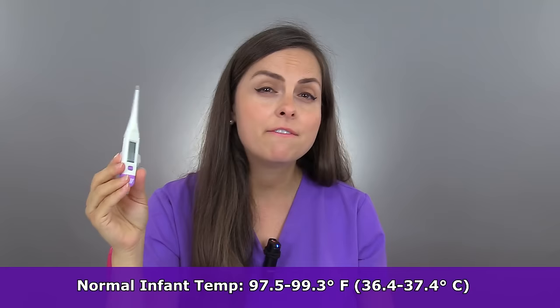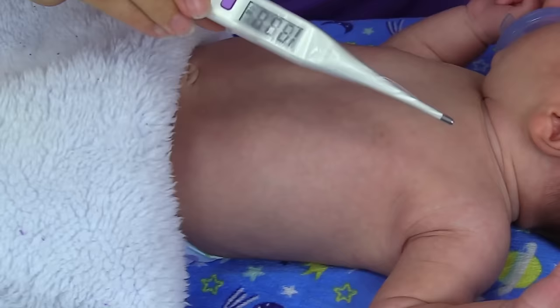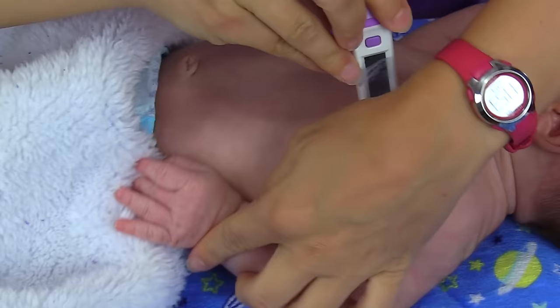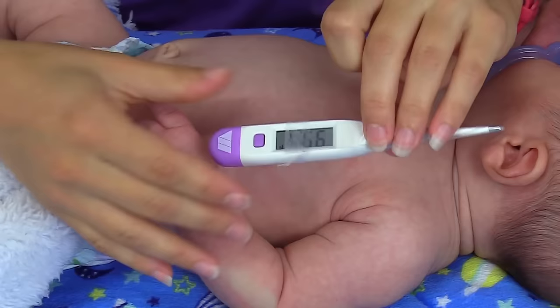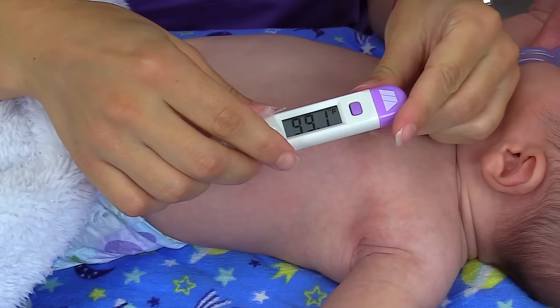To check the temperature in the infant, we're going to check it via the axillary route — we're going to place the thermometer tip in the armpit of the infant. I've already placed the protective sheath over the thermometer. A normal temperature in an infant can vary anywhere between 97.5 to 99.3 degrees Fahrenheit. Make sure you turn the thermometer on, then place the tip deep inside the fold of the armpit and put the arm down. Wait for the thermometer to beep. The reading is 99.1, which falls within normal range.